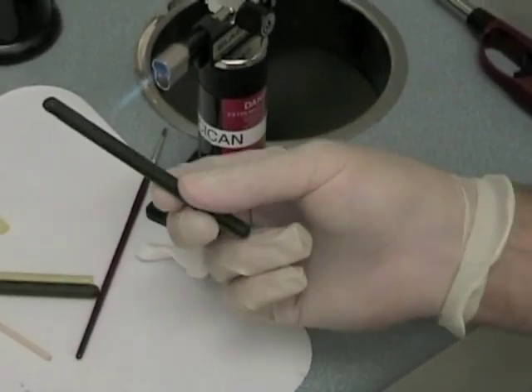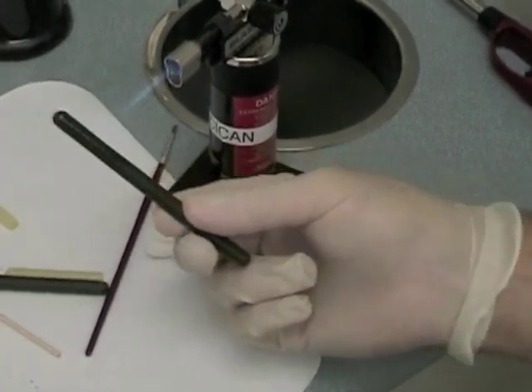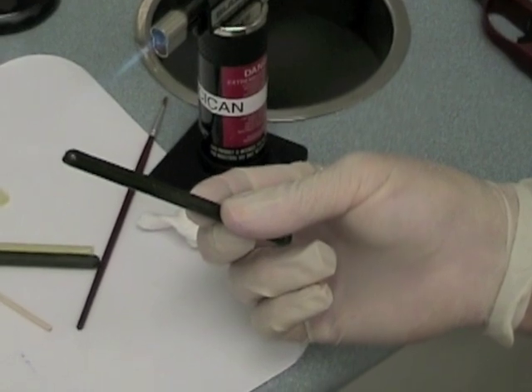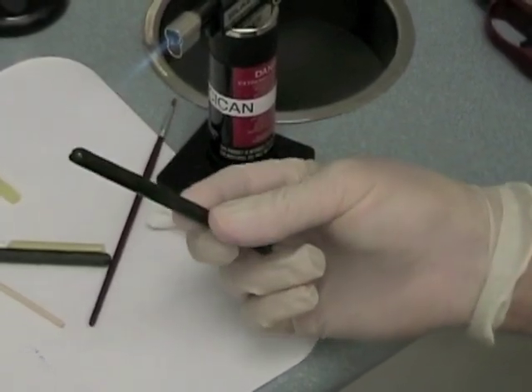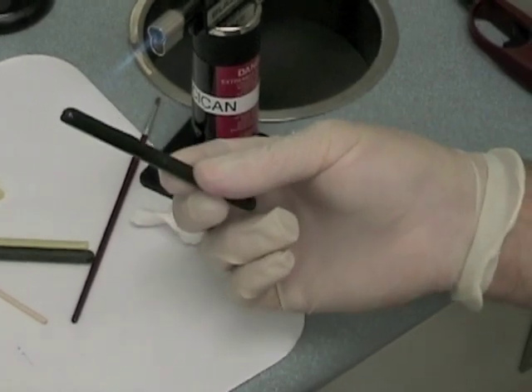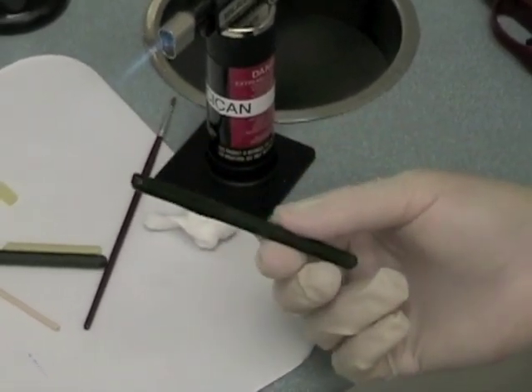Use a Bunsen burner or a butane torch to soften the compound. A Hanau alcohol torch will not normally heat the compound enough to soften it thoroughly. Warm the compound until it just starts to droop. Do not overheat it, boil it, or burn it.